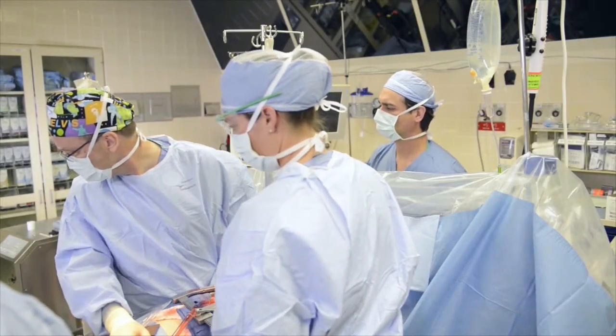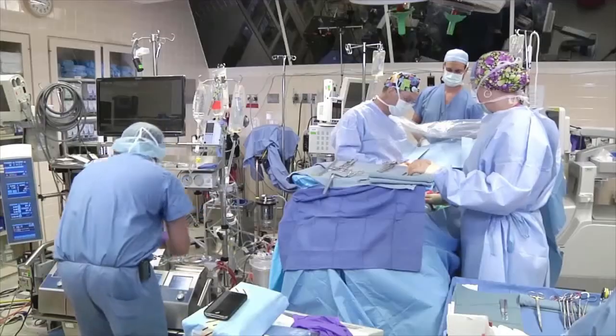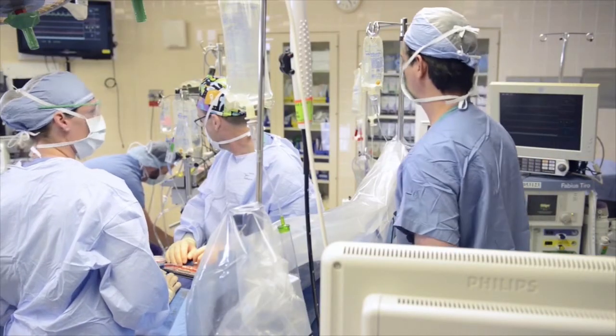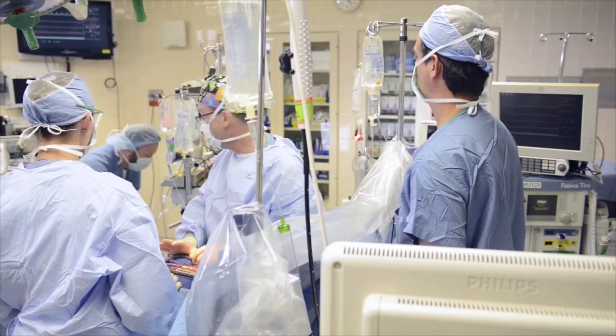What's that alarm? Circuit alarm. I'm checking it out. I think we're okay. Let me just re-zero the transducer. What's going on? The guy's ischemic.